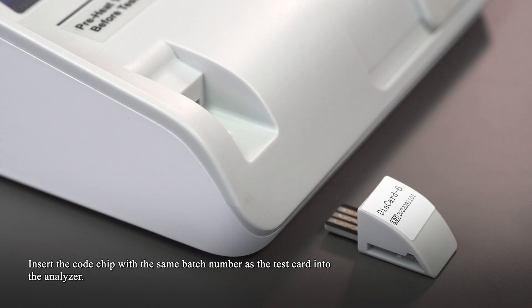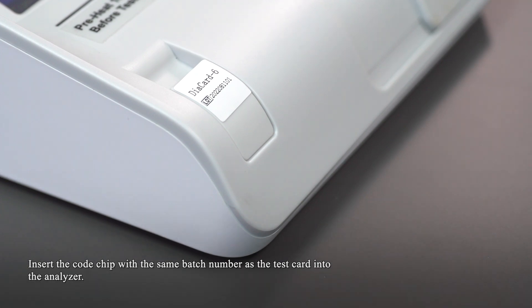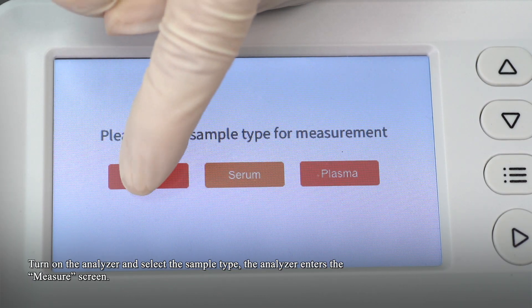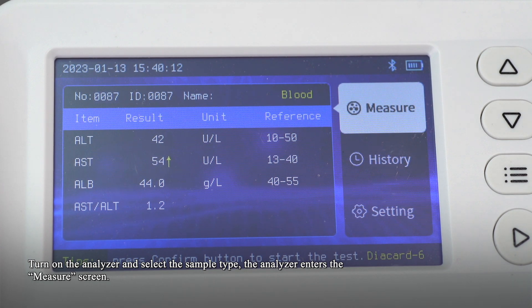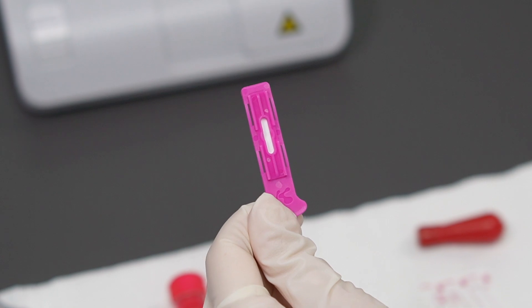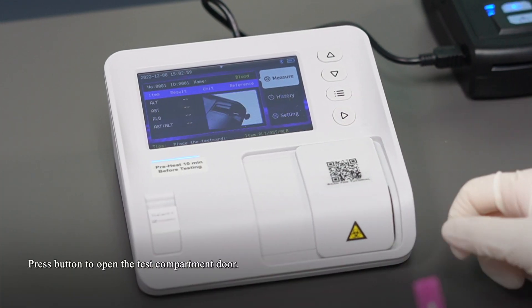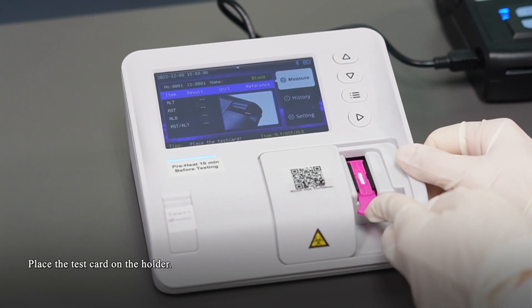Select the code chip with the same batch number as the test card and insert it into the analyzer. Turn on the analyzer and select the sample type. The analyzer enters the measure screen. Press the button to open the test compartment door and place the test card on the holder.